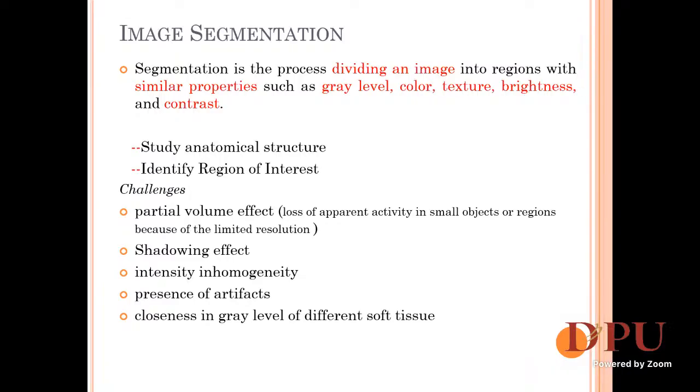Now the idea is, once you put the probe, it has some shadow. The probe is nothing like a stick. Now, the probe has some shadow. So within that shadow region, if there is some calcium, even if you try to segment the wall, you will see the result will not be correct. This is called the shadowing effect.